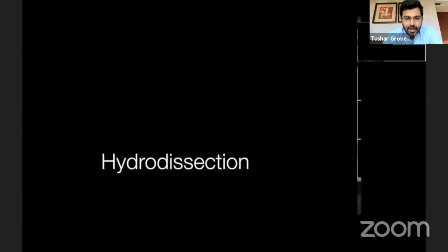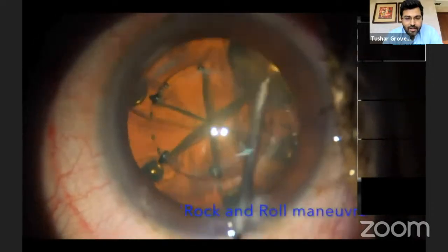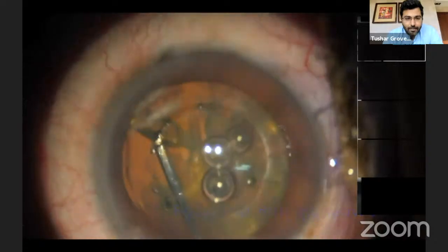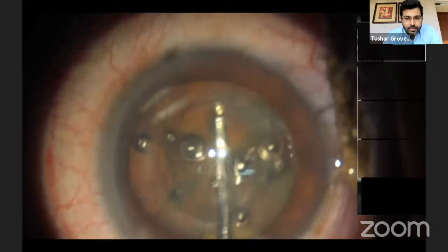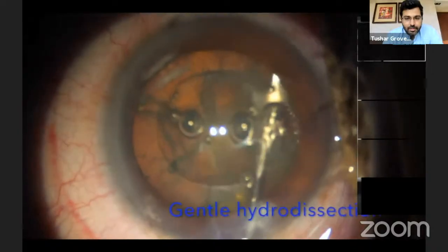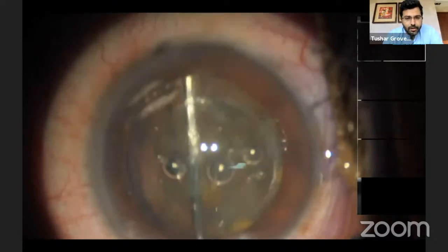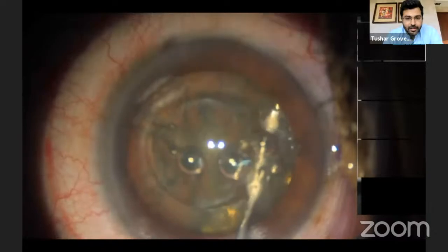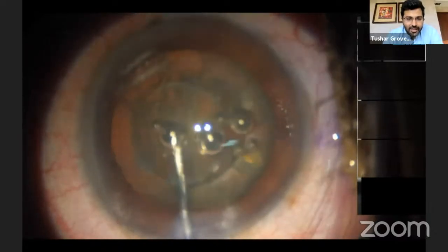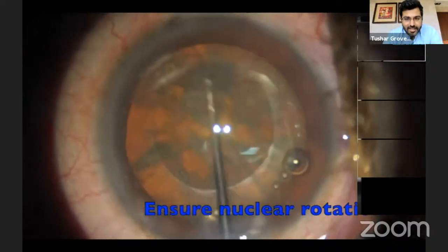Another initial step that's important to be careful with is the hydrodissection. You have these air bubbles that are trapped posteriorly, so it's best to do a gentle rock and roll maneuver, bring up these posteriorly trapped air bubbles. And once you've done that, do a gentle hydrodissection, important to be a little more gentle in these cases as compared to routine phacoemulsification. And as in routine cases, it's important to ensure nuclear rotation in these cases as well.